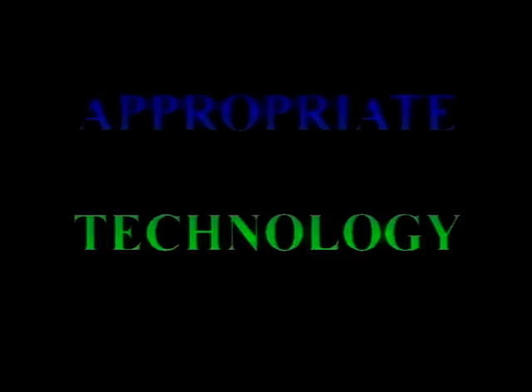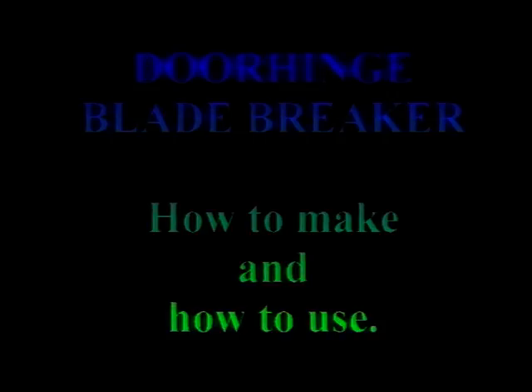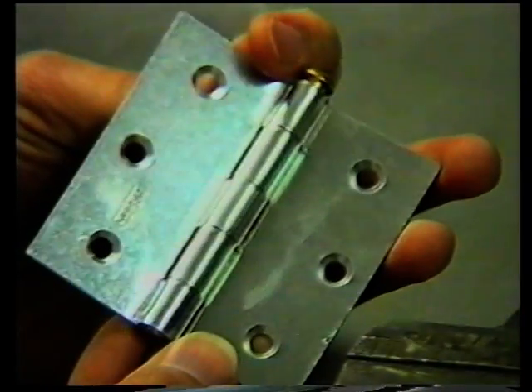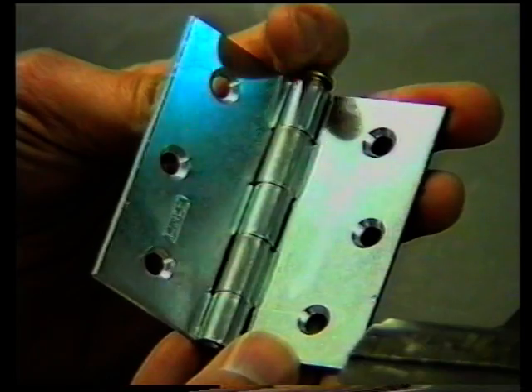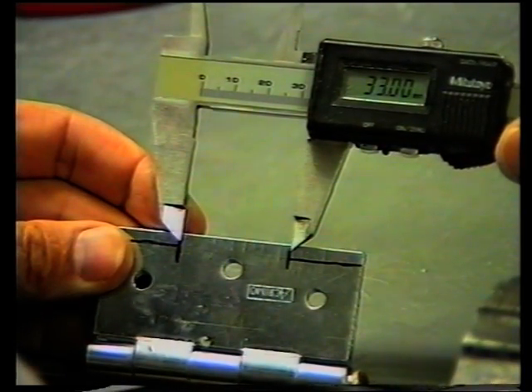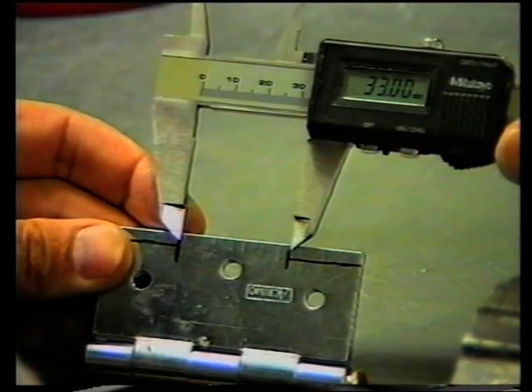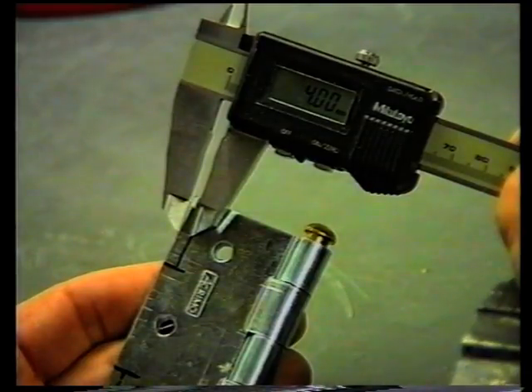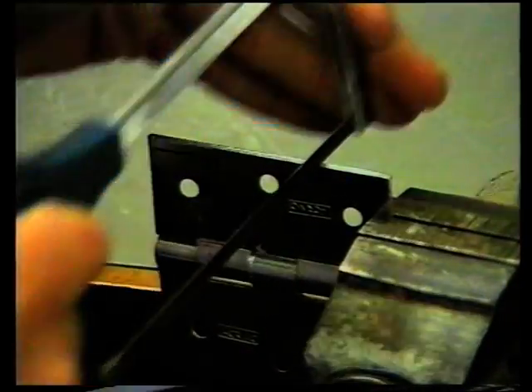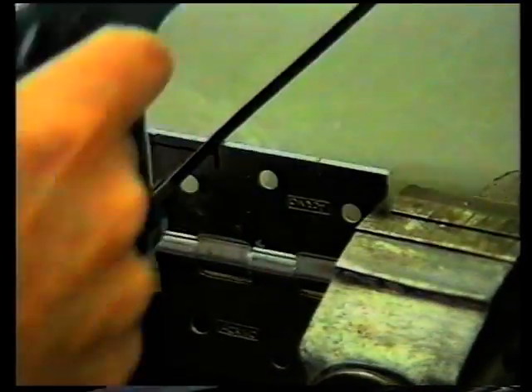Appropriate technology is a method to make do under conditions which are less than optimal, in particular in developing countries. We are going to show a number of techniques whereby the do-it-yourself surgeon can make his own tools, like the door hinge breaker of Gillette blades. The times are over that one could obtain breakable blades all over the world, and now the blade must be broken and bent with a self-made door hinge blade breaker.